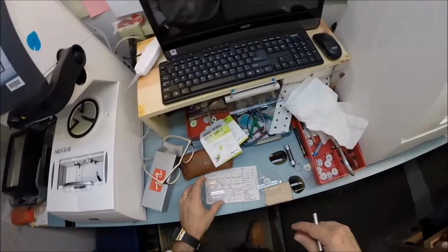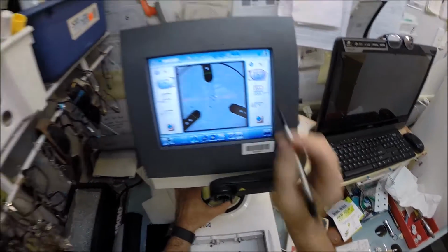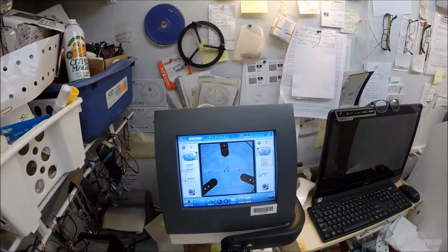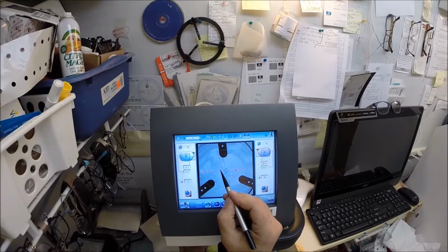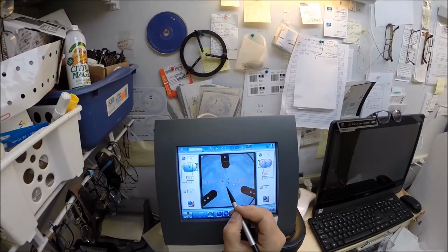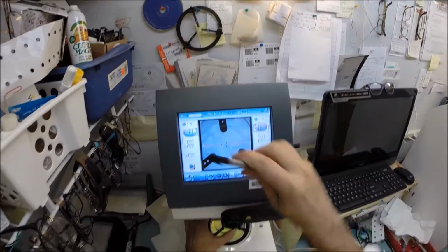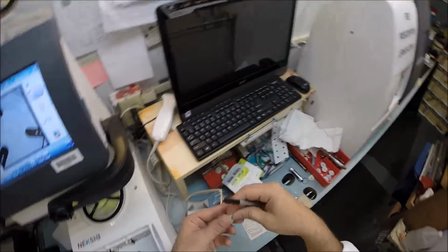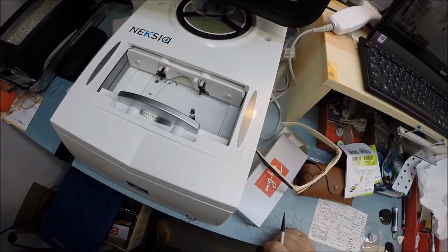I'm going to do the same thing now for the left lens. It automatically mirrors, so it gives me a PD of 30. Your combined PD is 60 divided by 2 gives me 30 in each eye. I'm going to get your left lens, the optical center, lined up inside that orange cross, and then make sure these two dots are on that center line, and that gives me a straight and even meridian. Where's that other sticker? Here we go. Take the paper off, line the magnets up, hit the button, and then the arm comes down and places the block onto the left lens.